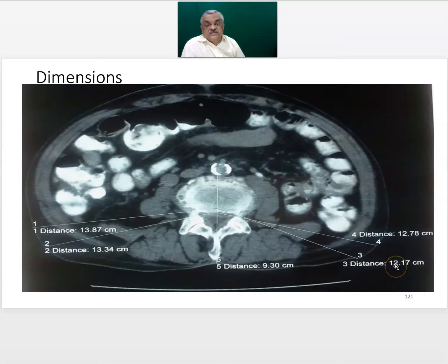So in our patients, Indian patients with average height of 5 feet 6 inches in a male and around 5 feet in the female, we must stay between 9.5, which will be coming here, to about 13 and go at this angle. Then it is very safe for our access to the disc, especially in case of disc herniations, central, paracentral, foraminal, extraforaminal.